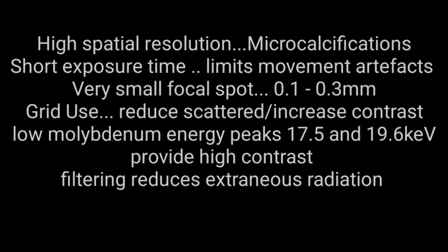With respect to mammography, high spatial resolution is required to detect microcalcification, because microcalcification is one of the very important signs to differentiate between benign and malignant lesions. The second thing is you need a very short exposure time, because increased time will increase movement artifacts, while a short exposure time limits movement artifacts.